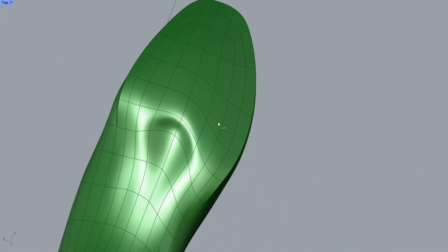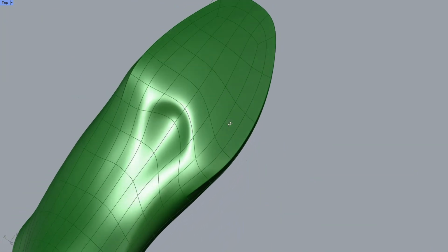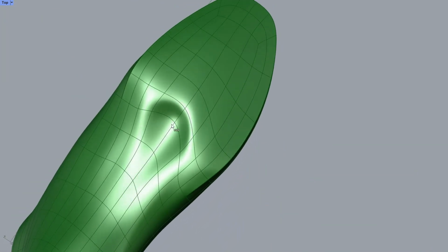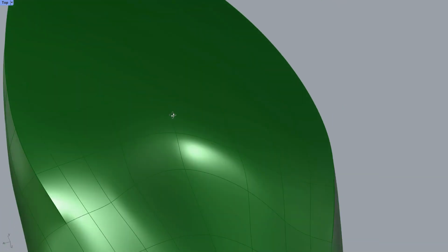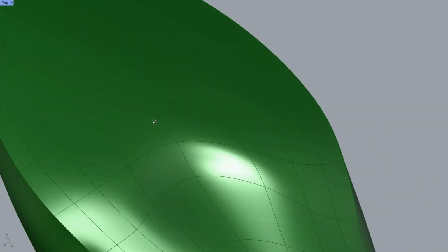But I also make these kinds of supports made of soft material, and then I do not model the last like this, but I simply glue on the insert, we call it the supplement, a separate retrocapital support.